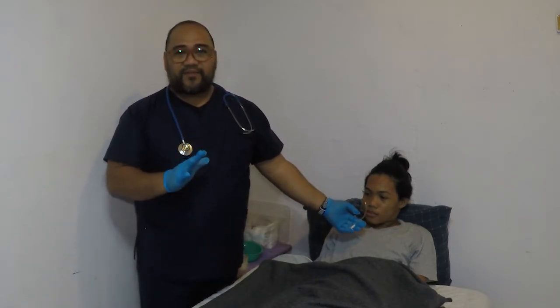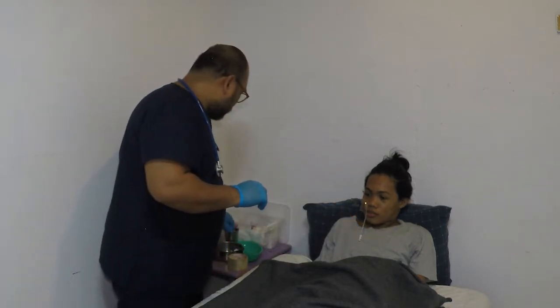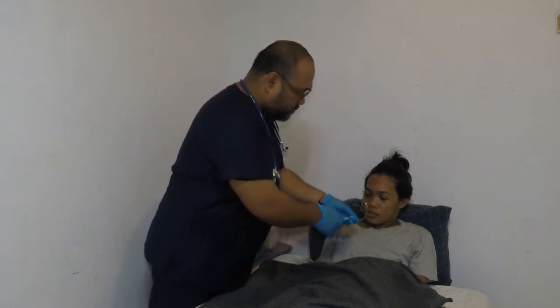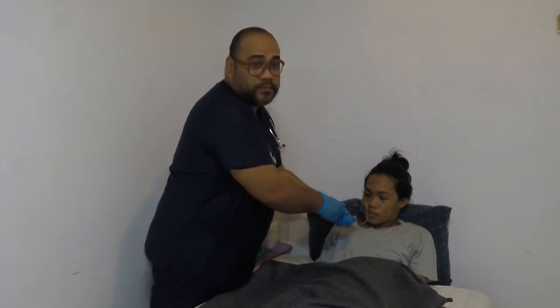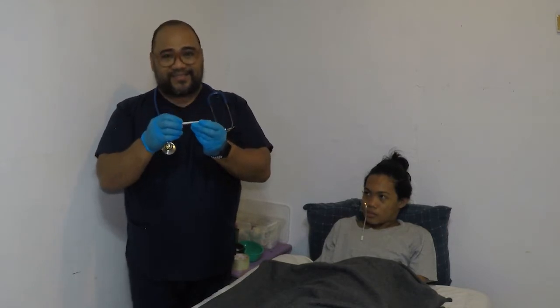Aspiration of a small amount of stomach content: attach the syringe to the end of the tube and aspirate a small amount. Visualize the aspirated contents for color and consistency.